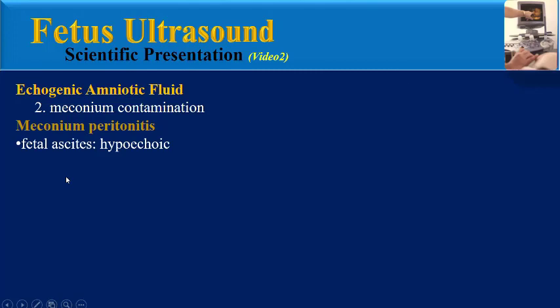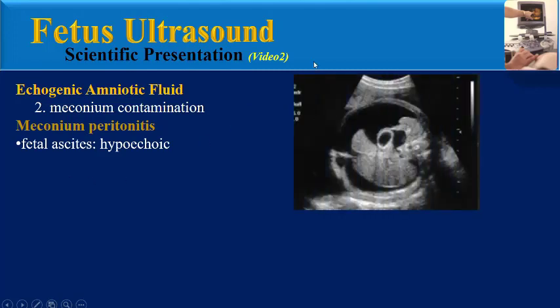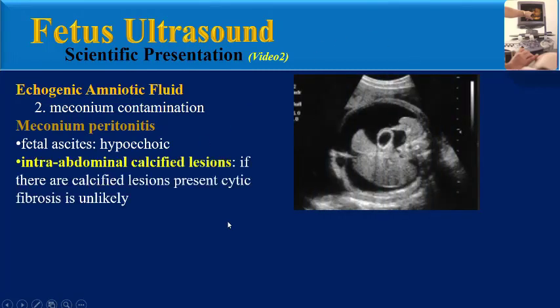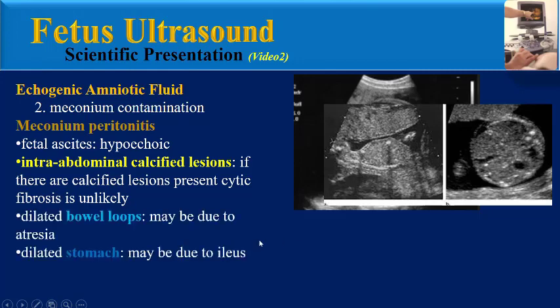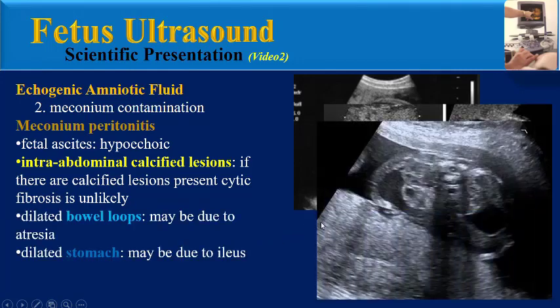One of the findings of meconium peritonitis is fetal ascites, which is hypoechoic fluid, along with intra-abdominal calcified lesions. An important point: if calcified lesions are present, cystic fibrosis is unlikely. Dilated bowel loops may be due to small bowel atresia, and dilated stomach may be due to ileus.